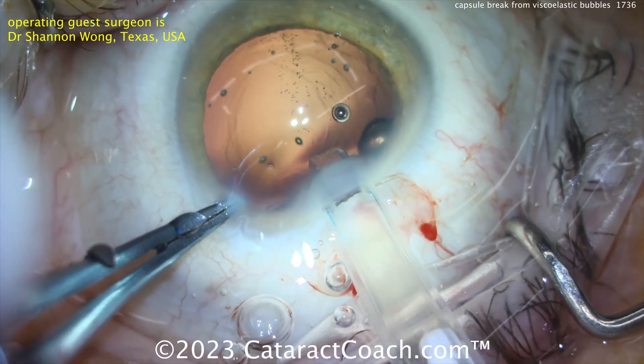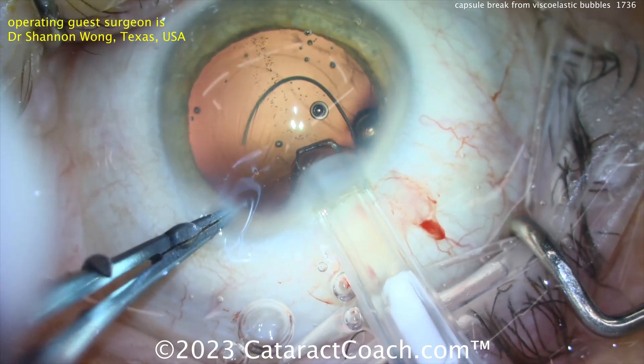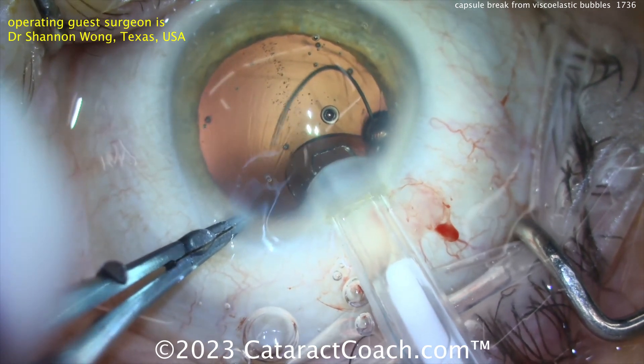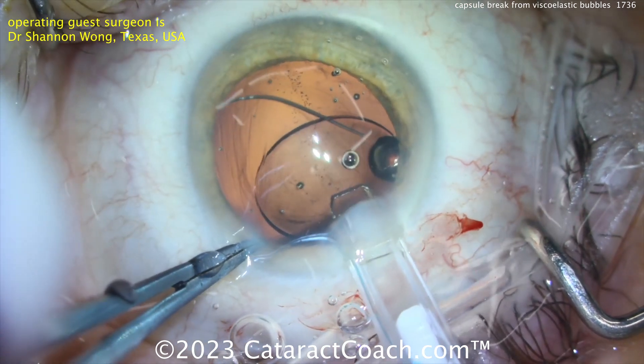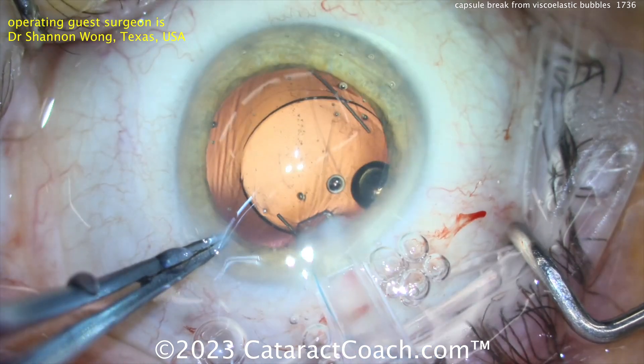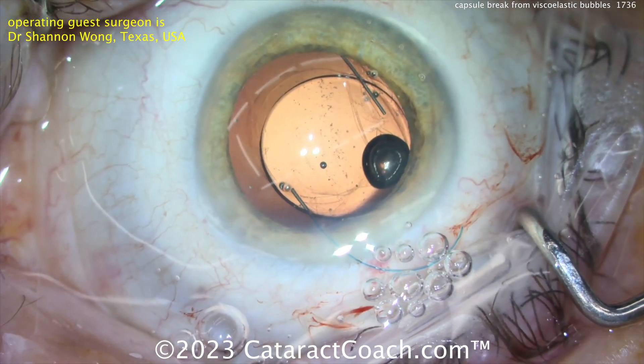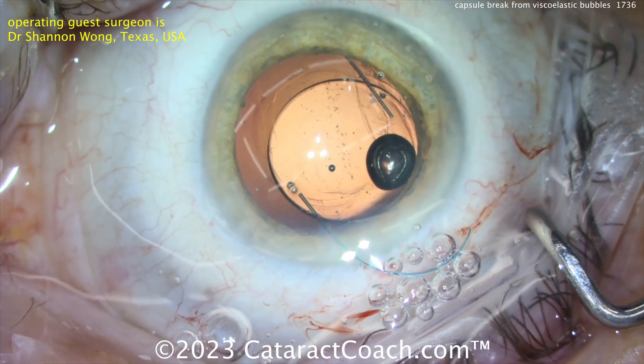The leading haptic comes out and goes into the sulcus nice and easy. Then the optic comes out, and the trailing haptic is placed in the eye as well and positioned. This viscoelastic is HPMC — hydroxypropyl methylcellulose — in both cases.